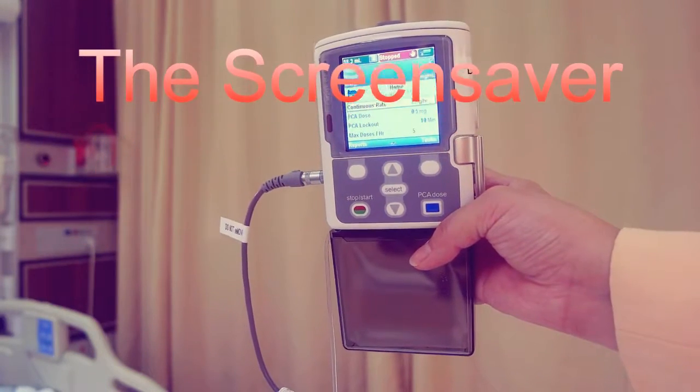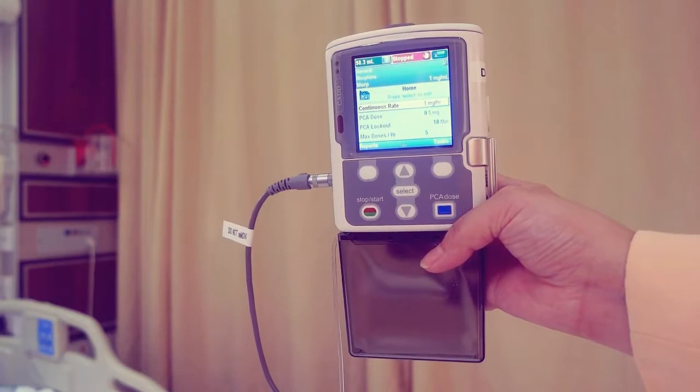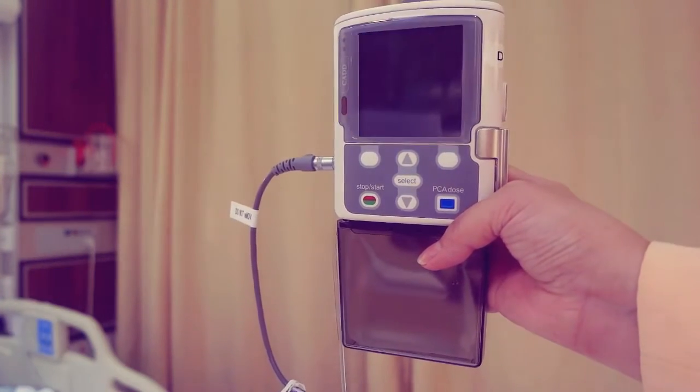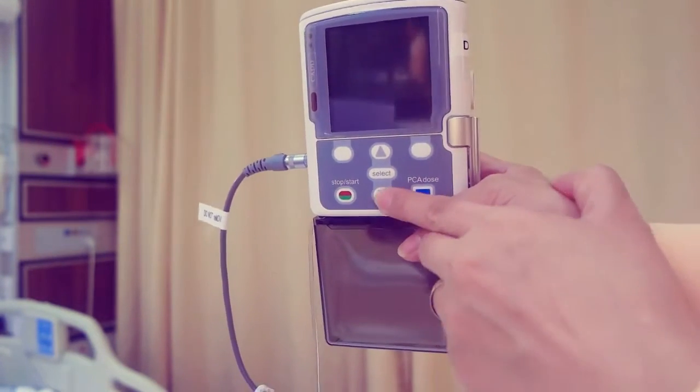The screen saver allows the pump to conserve battery power when not in an edit mode and if no keypad buttons have been pressed for 30 seconds — the pump displays a blank screen. Press any button on the keypad to turn the display on.